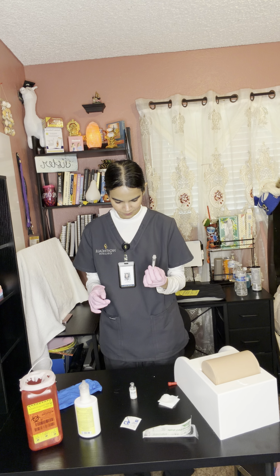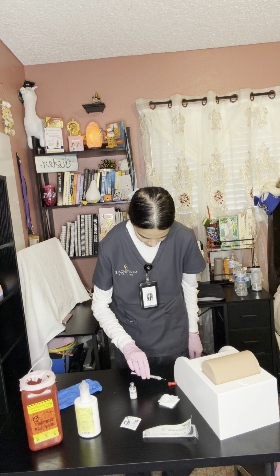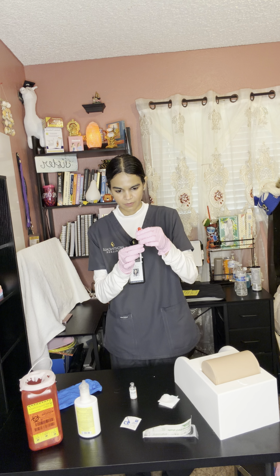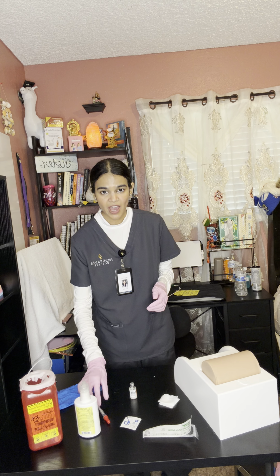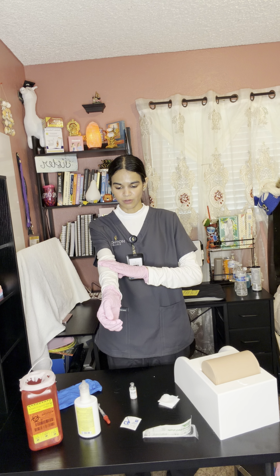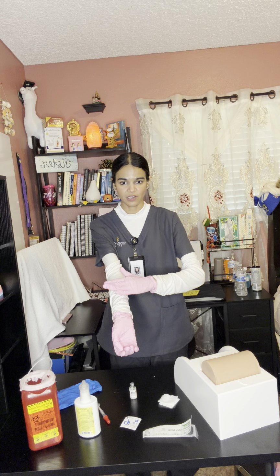Next, I will recap the syringe with the one hand cap method. I'll keep the syringe to the side. Now I will begin to choose a site where I will administer the tuberculin shot. It is best to have 3 to 4 fingers below the antecubital area or have a hand's width above the wrist, so this generalized area.